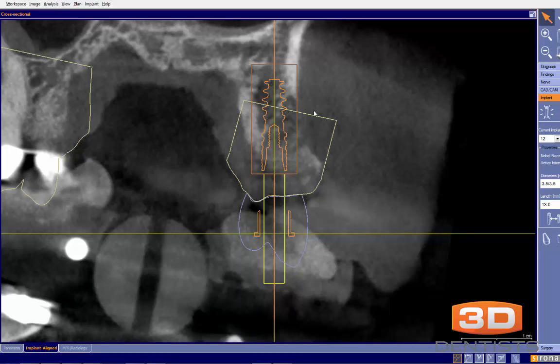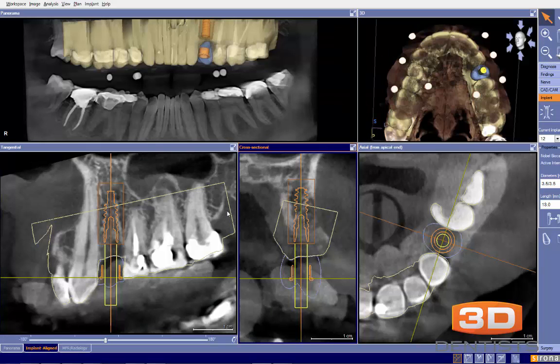So in this case, this wouldn't prevent me from doing the implant treatment. It would just make me be ready to possibly have to graft that area. In other words, there's a chance that this bone hasn't fully formed. There's still a dehiscence there, maybe even some granulation tissue has crept in. So I would be prepared to flap this area back to make sure that's clean, and add a little bit of graft material, just to verify that that area is completely clean.